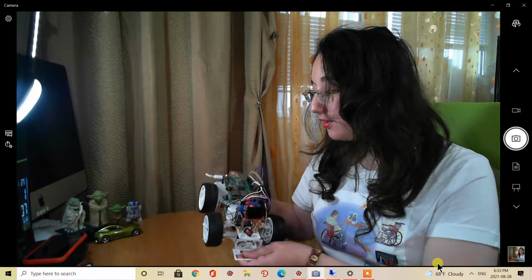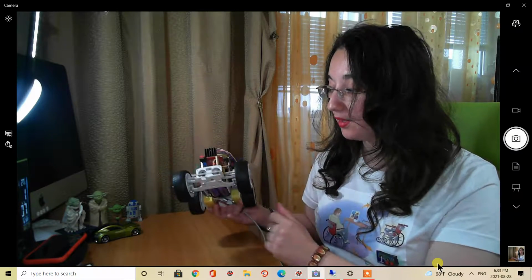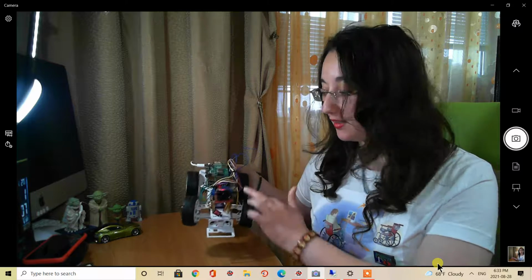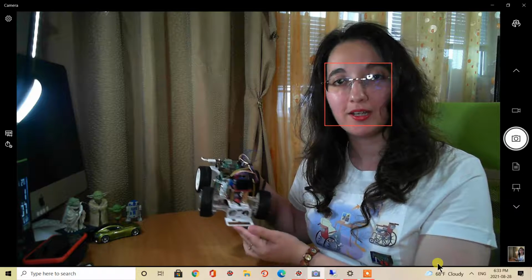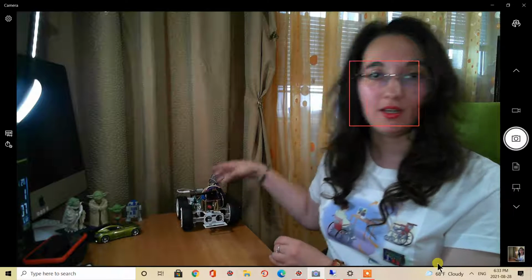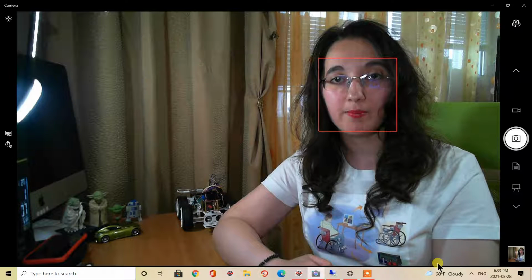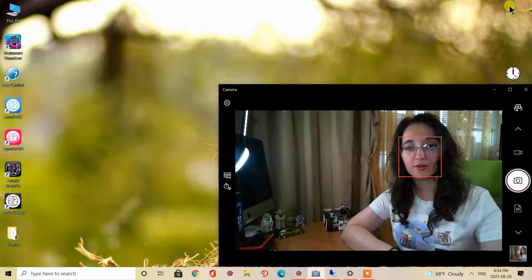In its structure, there are also two direct current motors, four wheels, one servo motor for changing the movement direction to the right or to the left, and a driver motor L298N that is based on the dual H bridge. As you can see, it is turned on. I developed two applications in the Python programming language that are running both on the Raspberry Pi level and on my computer. So I will show you them.